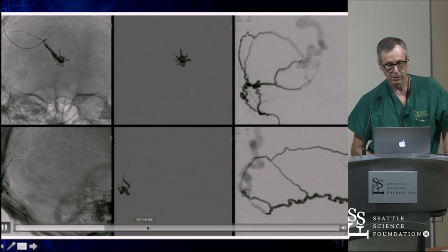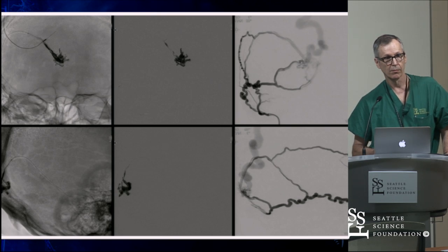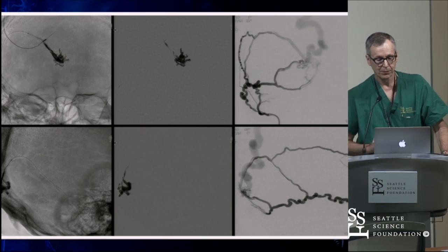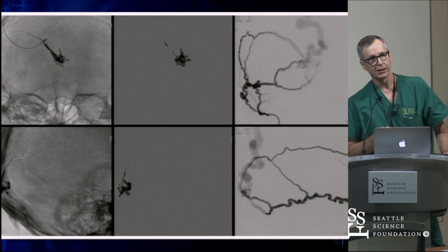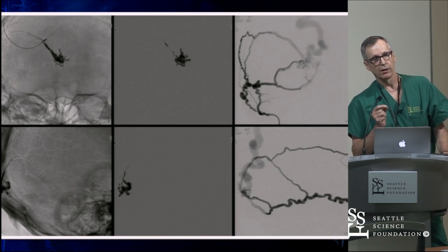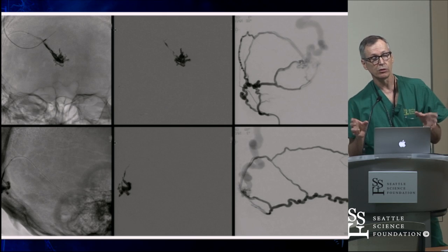So, question there, Cameron. The fistula's point looks pretty focal, but you almost always need to inject so much goop in there. Why do you think that's the case? I'll show you that a little bit on this one. That isn't the case, I don't think, if you're in the right spot. You were in a perfect spot there. But it's a big vein, and you have to occlude that vein.